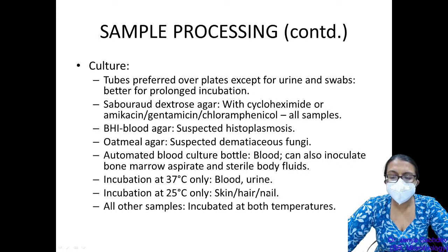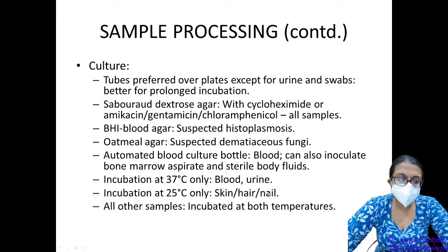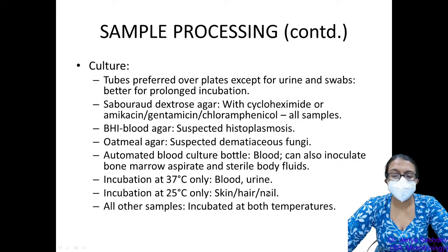In skin, hair and nail, again, we don't usually suspect yeast infections because yeasts are normal commensals in skin, hair, and nail. Yes, in rare cases, you can have Candida causing a nail infection, but usually we suspect dermatophytes. There is a certain class of molds in this sample. So we incubate it at 25 degrees Celsius only, because molds grow better at 25, yeasts grow better at 37.